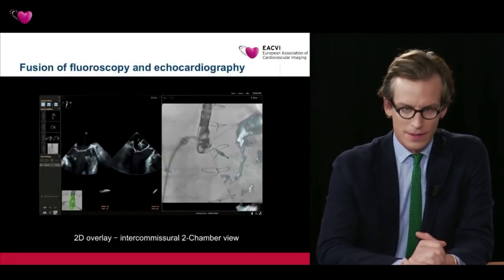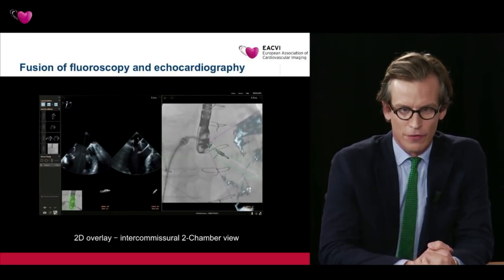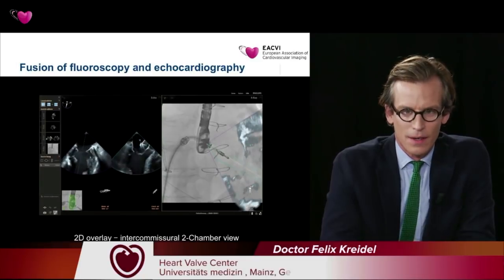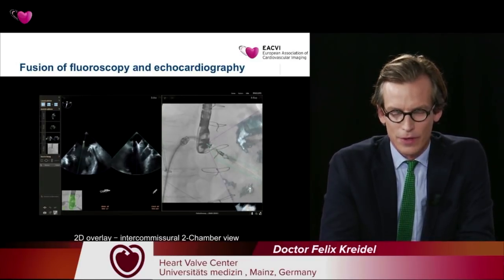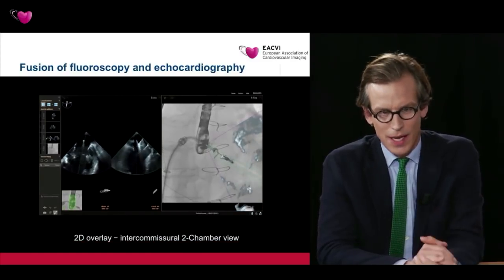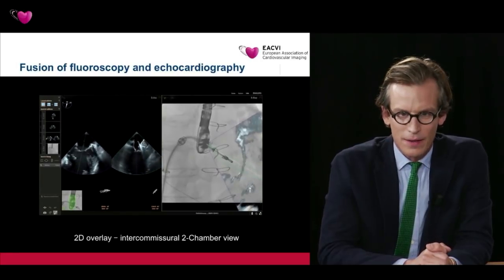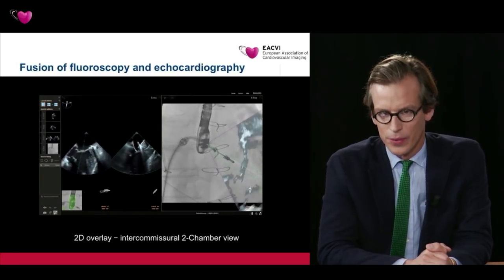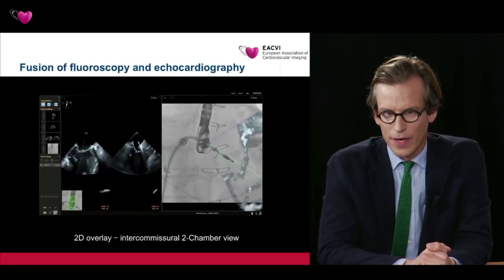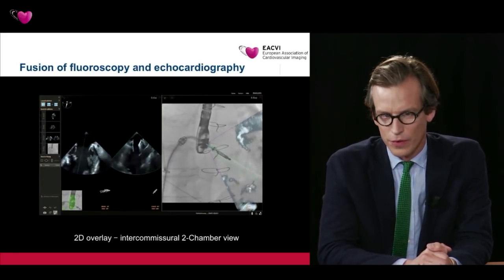We have these fantastic imaging modalities. Why not combining, fusing them onto one screen? And I show you this slide as sort of an opener into the discussion, and you see the just mentioned X-plane image of a mitral valve on the left panel, and on the right panel you see a fluoroscopy image with a MitraClip device and the overlay of an intercommissural two-chamber view.